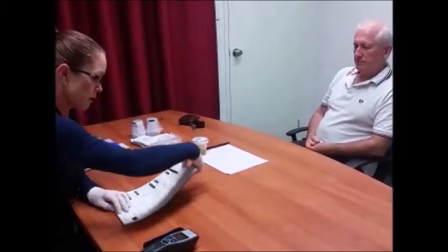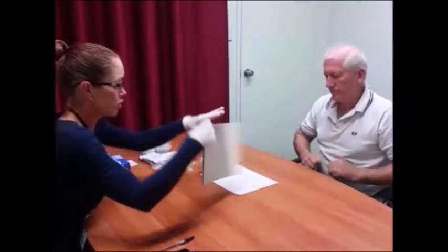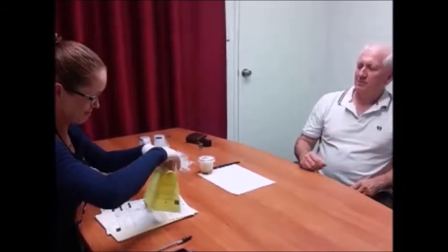Okay, I'm going to double check all of the information on my chain of custody, make sure that I have not missed anything. Okay, and I'm going to explain the results back to the donor and get your sign off at the bottom. Michael, your breath test is all 0. Your drug test is negative. I'll get you to pop your signature and date, please, at the bottom on the yellow shading. I'll give you a copy. Very fittingly, you get the yellow copy.